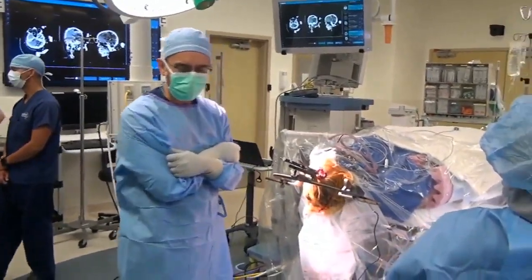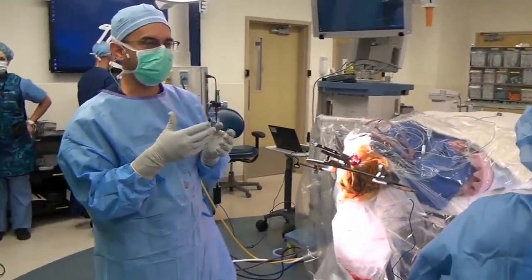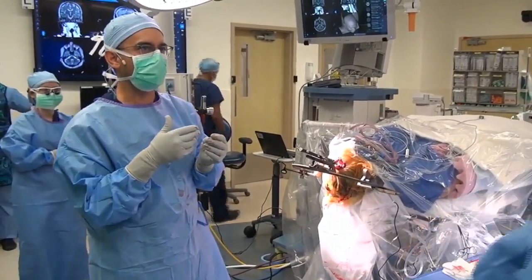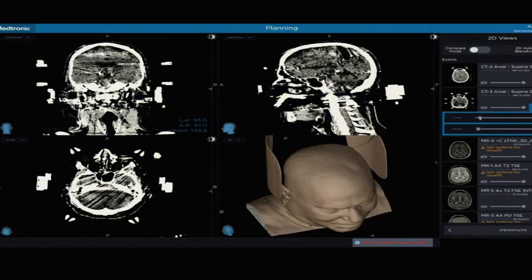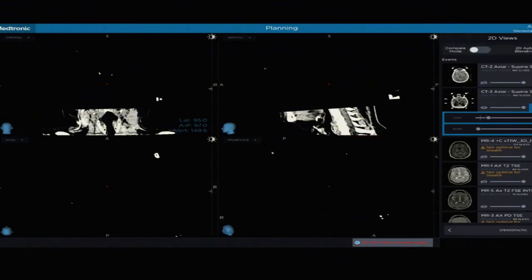So the programming is an iterative process, because especially with Parkinson's, you can lower medication. And I think we can go back to stealth. We're good on stealth now. You kind of take 2 steps forward, 1 step back as you advance the DBS therapy but reduce the medication.